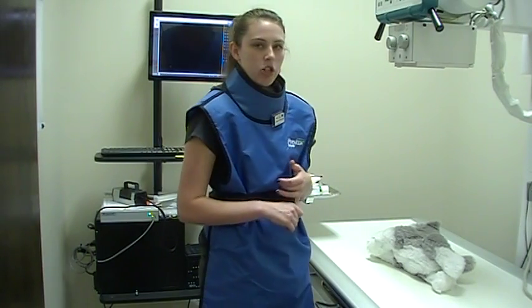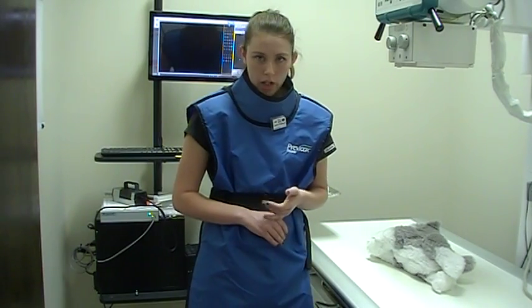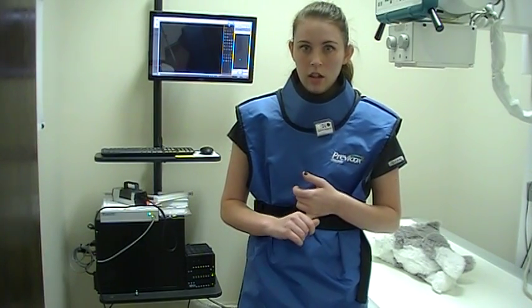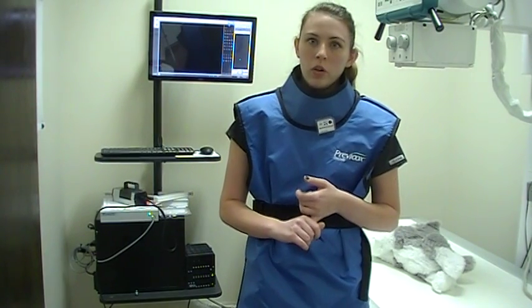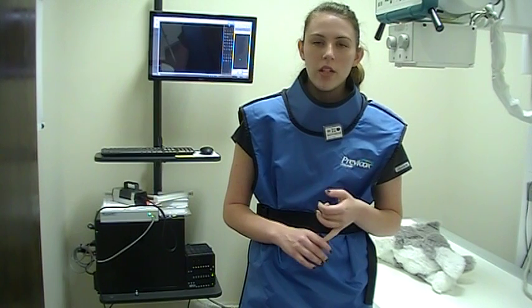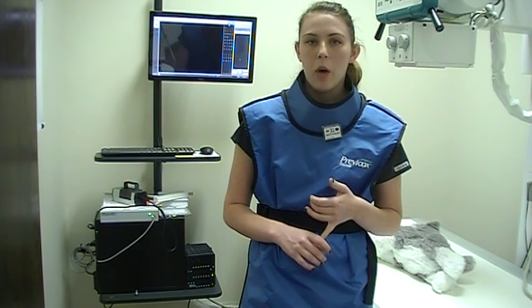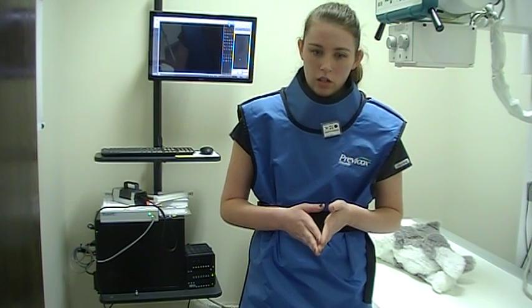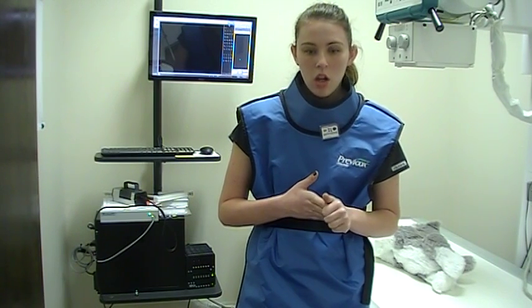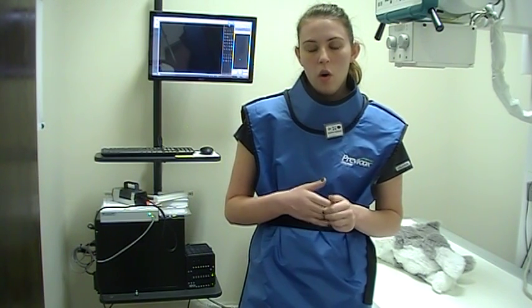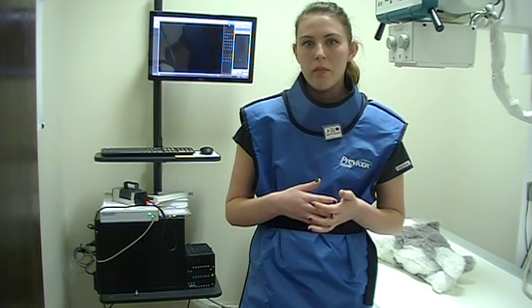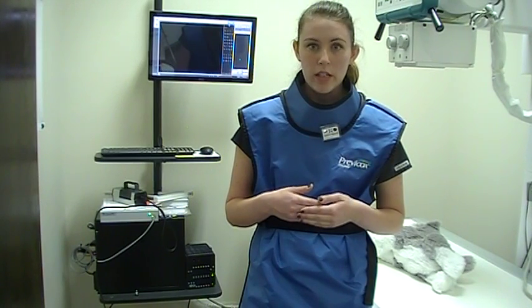The first thing we need to do is take a scout radiograph. A scout radiograph is a right lateral side view. The reason for a scout radiograph is to look for any obvious foreign bodies or anything that would make the gastrointestinal contrast study unuseful, or if there is any stool in the colon that we would need to administer an enema before performing the series.